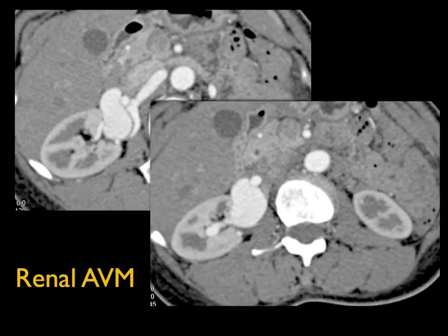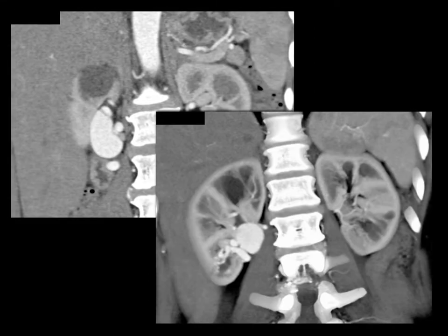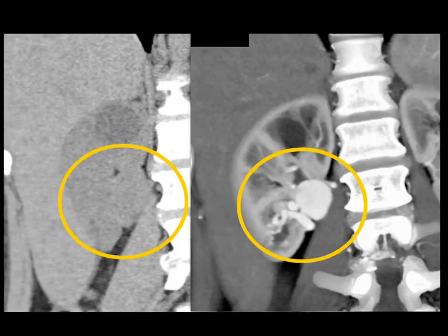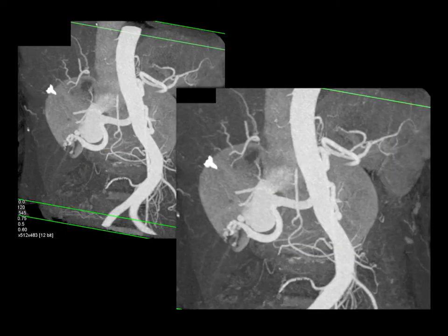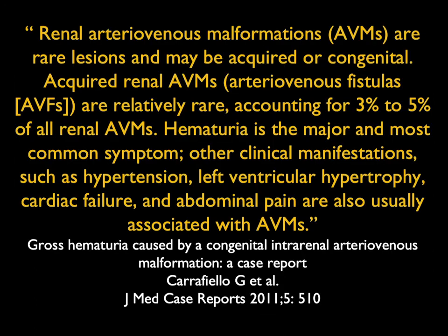Another thing in terms of vascular — this is why I'm always scared with non-contrast CTs. You look at this unimpressive gross hematuria, there are no stones. But when you do the arterial phase imaging, you miss this giant renal AV malformation. AV malformations like this are not seen on non-contrast scans. They often don't have mass effect or any change. Here it is on coronal, and you can see branching to the lower pole renal artery. If the non-contrast is negative, look how much you can miss: tumors from renal cell to transitional cell, infarction, infection, and vascular malformations.